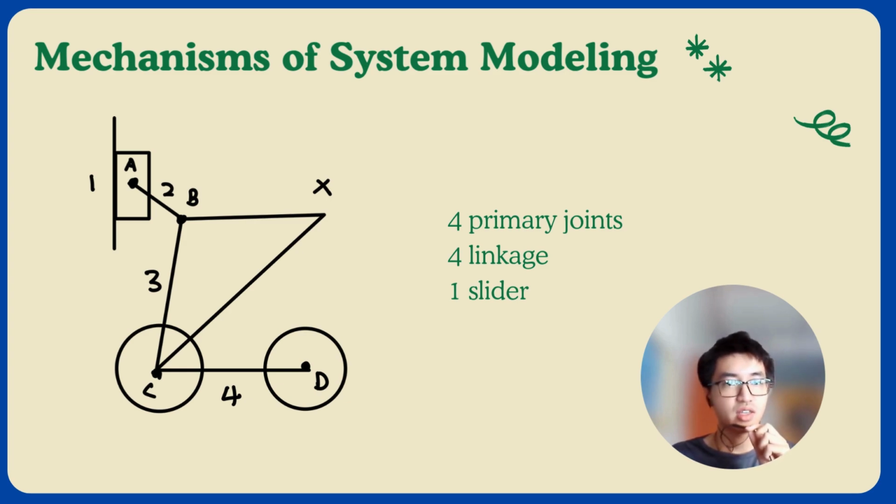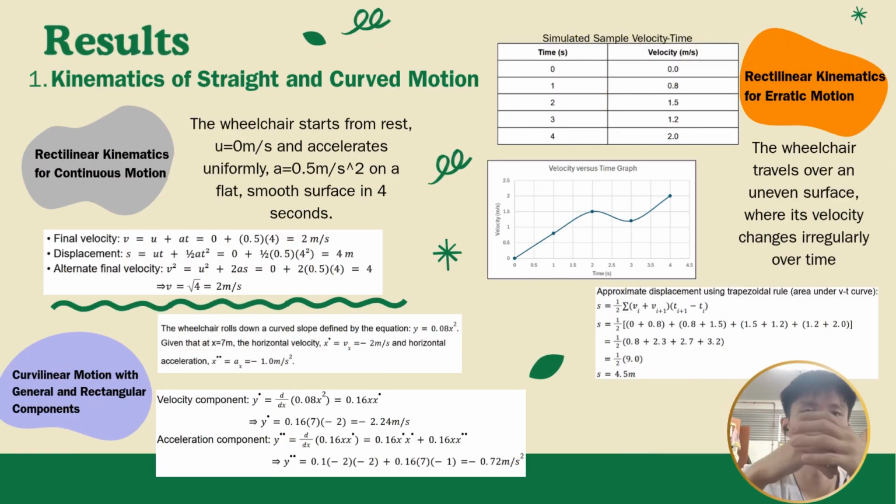Besides that, for the slider mechanism, we have chosen the folding frame as our slide, where it is located behind the main wheel of the wheelchair. We chose that part as our slide as we believe that it could help us reduce the size of the wheelchair by sliding it. In this study, we make assumptions of the scenario for the calculation of our topics.